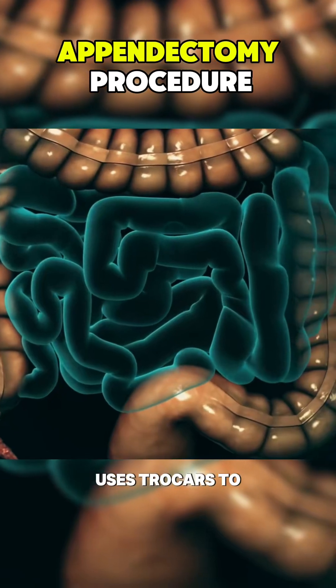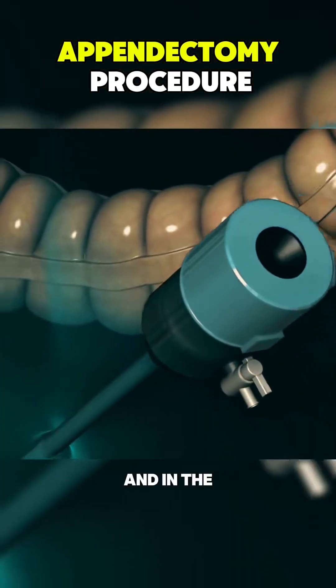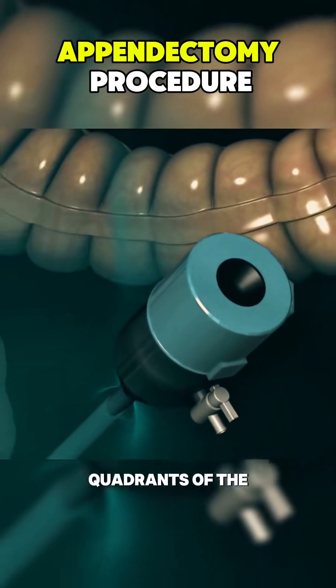The surgeon then uses trocars to make three small incisions, typically near the navel and in the upper and lower quadrants of the abdomen.